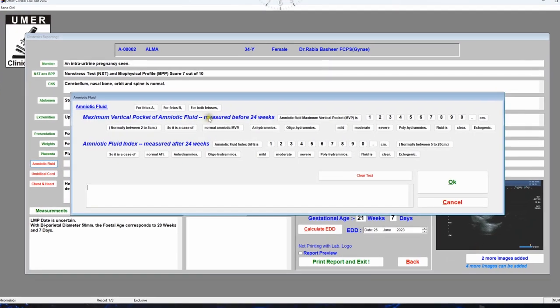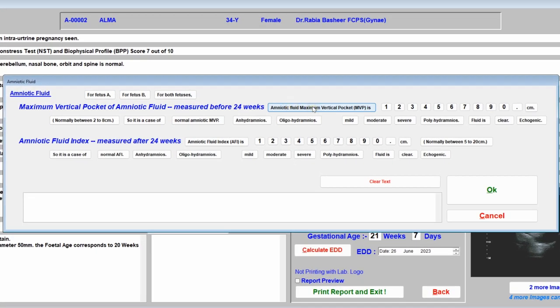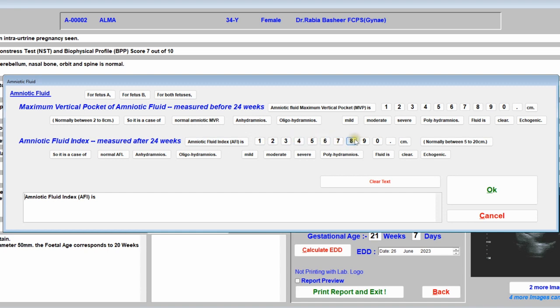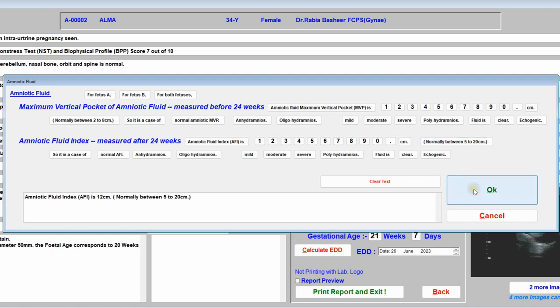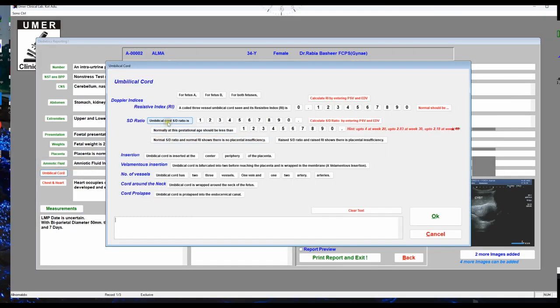For amniotic fluid: before 24 weeks, a single vertical pocket is usually reported; after 24 weeks, the four-pocket AFI is reported. Suppose the amniotic fluid index is 12 cm — click 'Normal'; the normal range is 5 to 20 cm. Click OK.